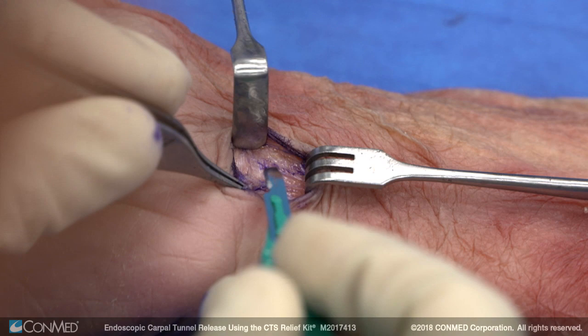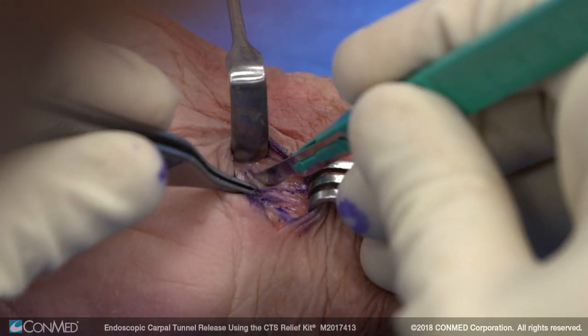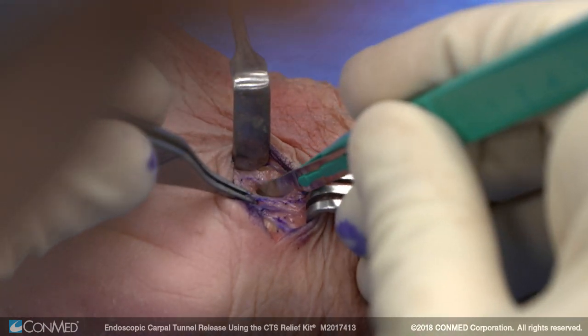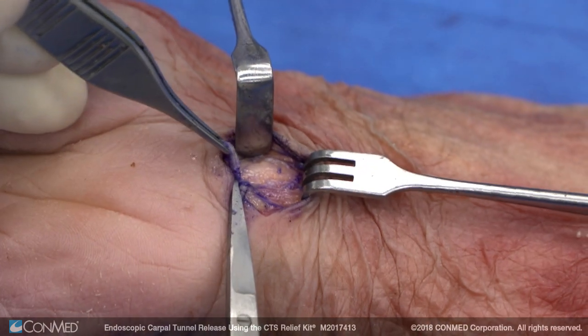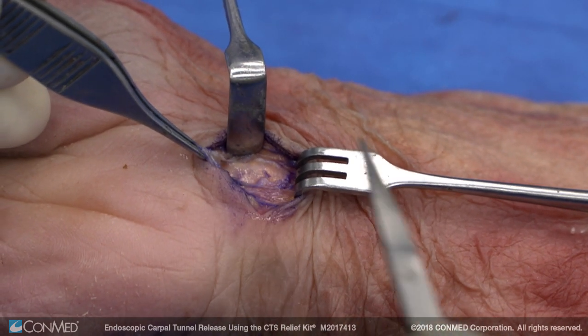Here's the anti-brachial fascia right here, and we're going to incise that to open up our carpal tunnel proximally. This is the edge of the anti-brachial fascia that you need to elevate to see your median nerve right here.